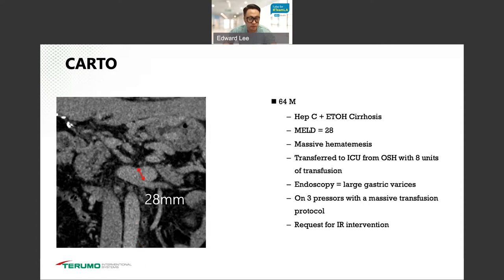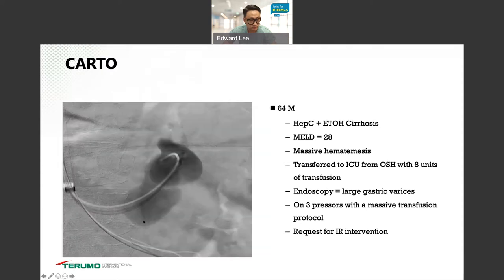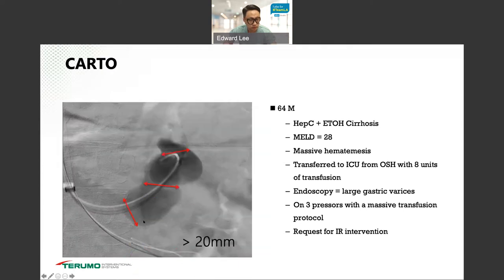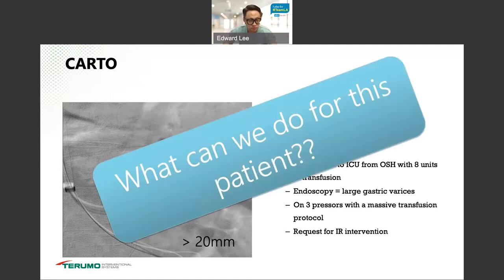So what do we do for these patients? The difference is this second patient has a very large shunt, which is different from the first patient. This is the venography showing the shunt being a lot bigger than 20 millimeters. So what can we do for these patients?